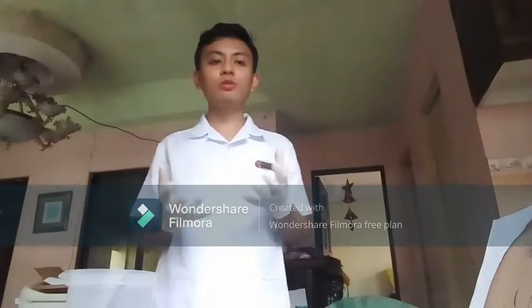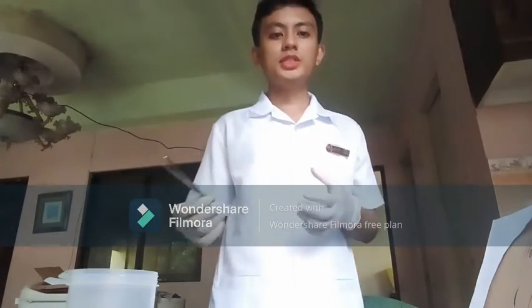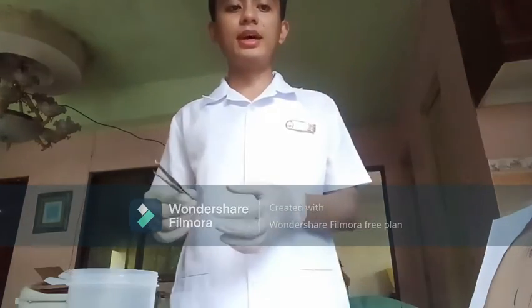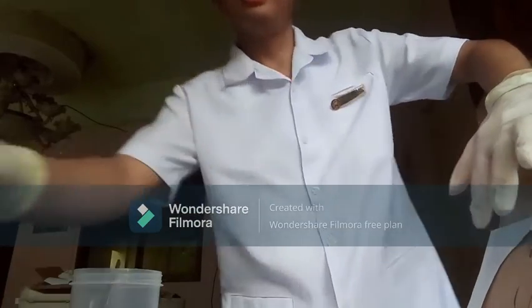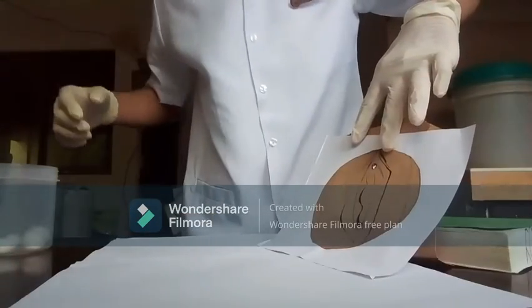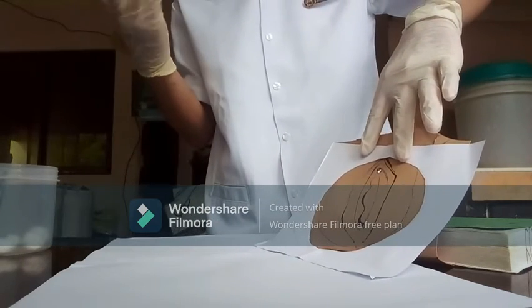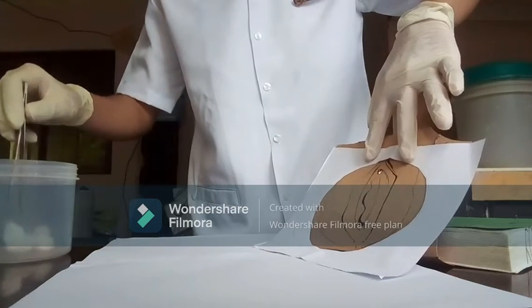So we will now proceed to the cleansing of the meatus, with the cotton balls using the forceps. Your non-dominant hand is used to spread the labia, while the sterile hand is used to pick the cotton ball with the forceps.